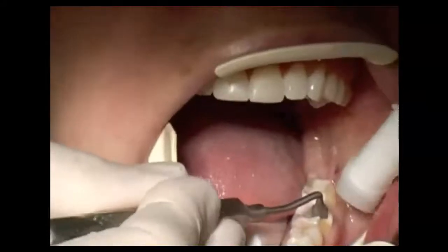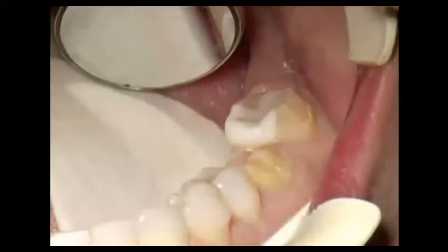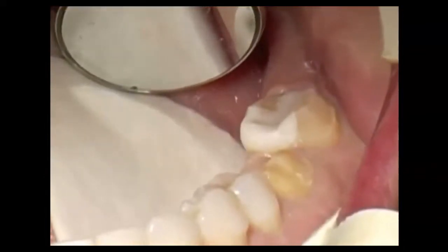So here they're using an instrument to separate the old restoration from the tooth.